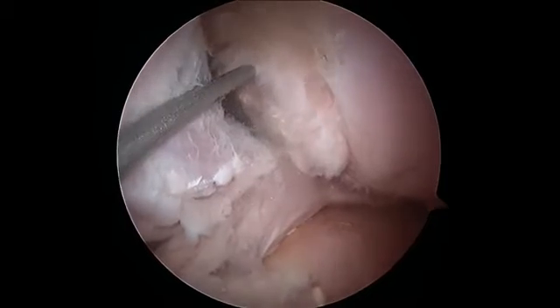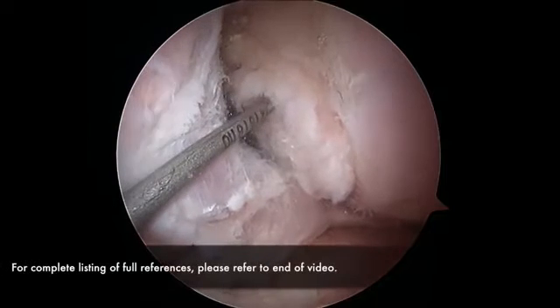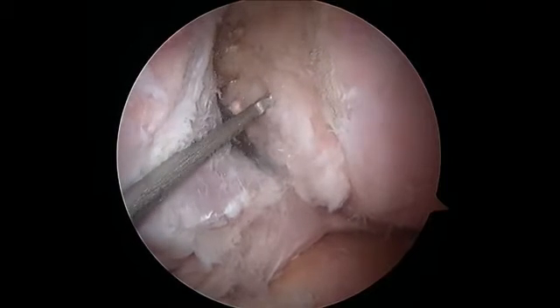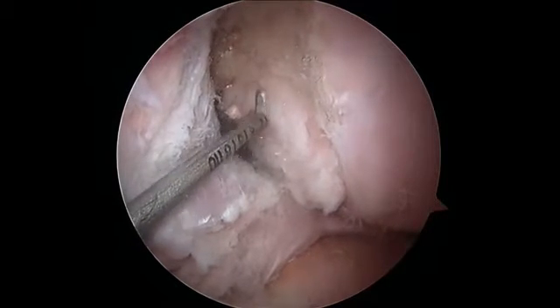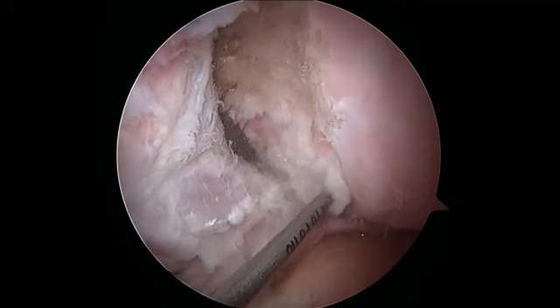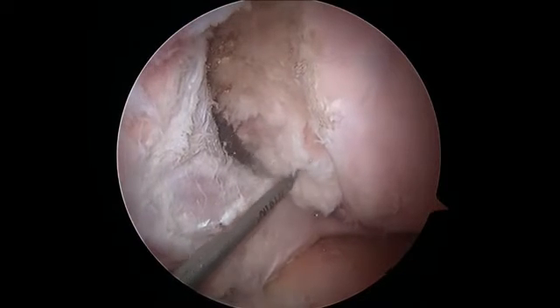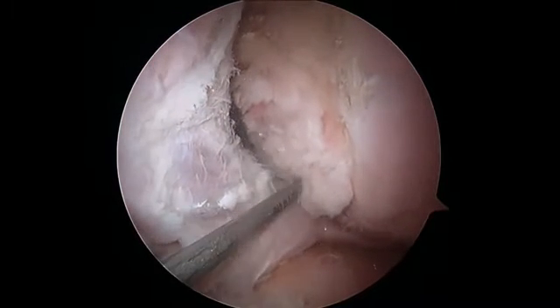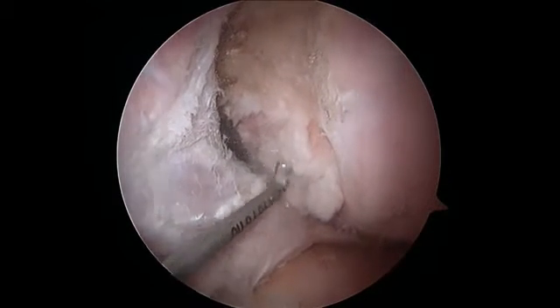So I'm going to point out the different aspects of the ideal position. The I in ideal stands for isometric, and work going back to the 70s has shown that this deep and high position in the footprint is the most isometric. This lower position, or more posterior position, off the posterior femoral cartilage is anisometric, and you see up to 15 to 20 millimeters of length change in a graft as you take it through range of motion if you put the graft down in this region. So the I is for isometric.